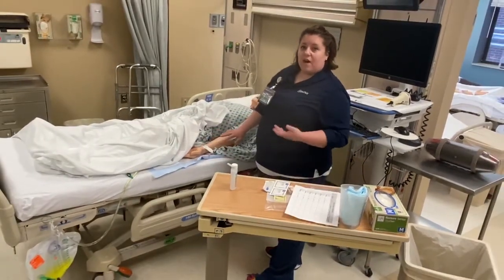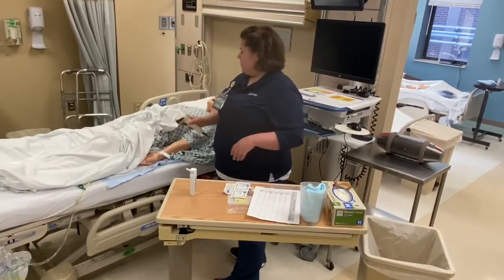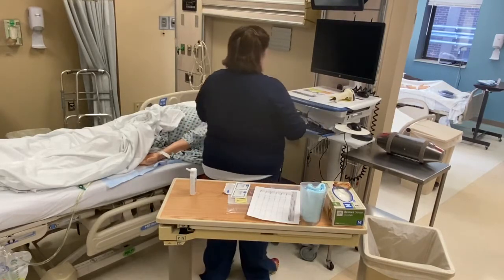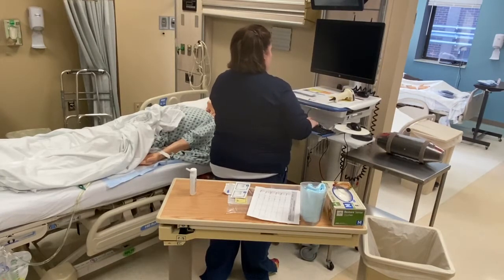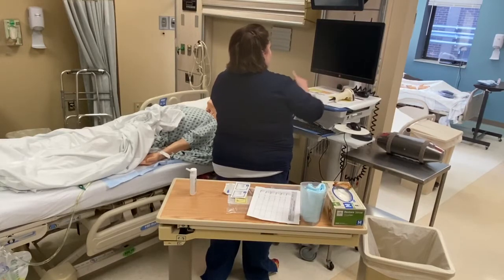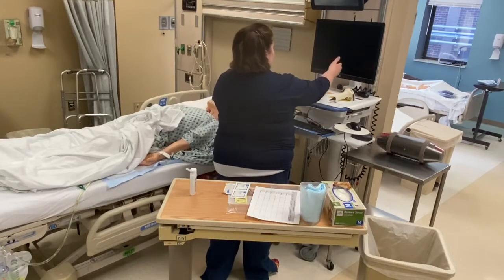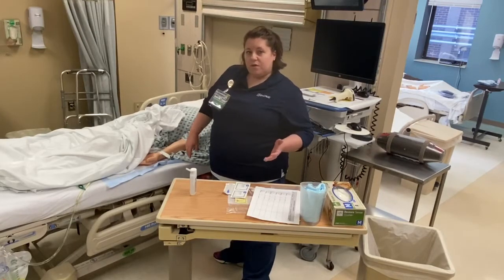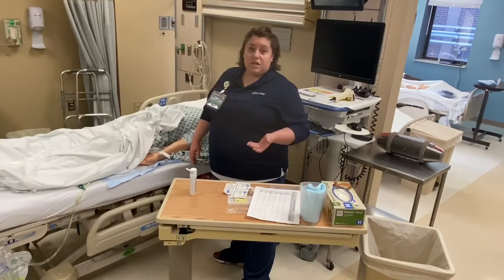At this point, I want to grab this scanner from my computer. I'm going to scan her bracelet, beep, and this is going to pull up her information on my computer. So I'm going to go to my screen. There will be a screen where I need to verify her information. I click verify, and all of her orders come up. And what I'm doing here is I'm looking to make sure that the order the nurse has given me is also in the computer. I see that it is, so I'm good to proceed. If the order was not in the computer, I would have to stop what I'm doing and call the nurse and let her know. Maybe the physician would need to put the order in before I can draw the specimen.